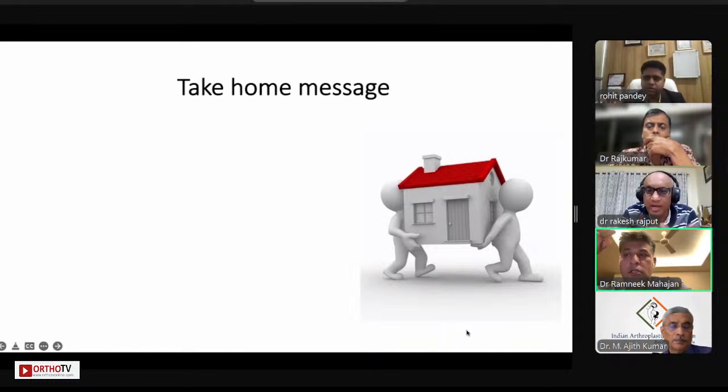And just to add to Rohit's point, Rohit, what you were just asked, going from this PS to a TS, let's say a semi-constraint, in this kind of situation just adds a slightly bigger box cut. That's it. Nothing else actually. Rest of all will just be there. Or if you don't want to use it, then with a normal femur, you can use a semi-constrained poly as well, with the stem down.